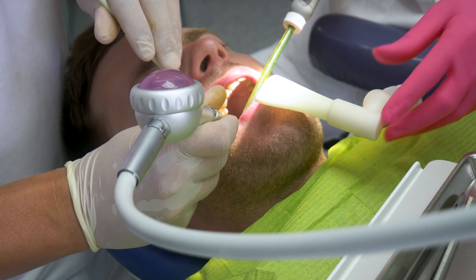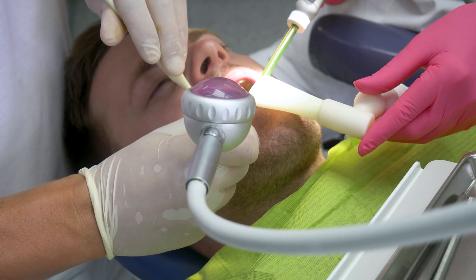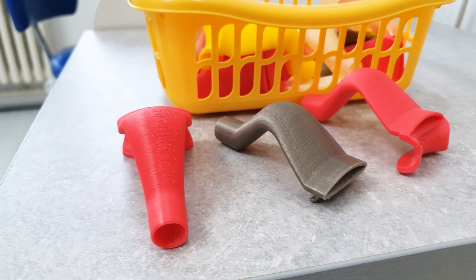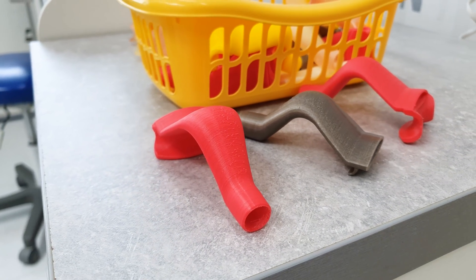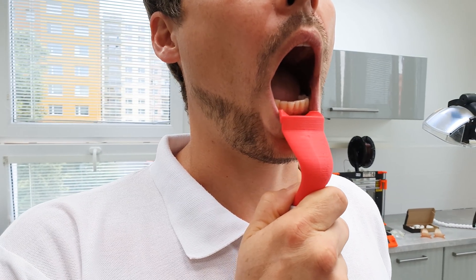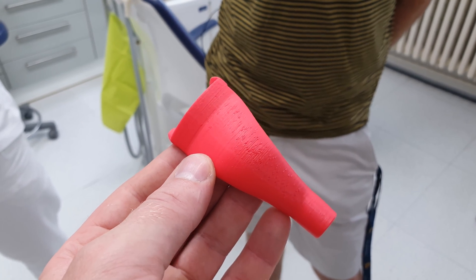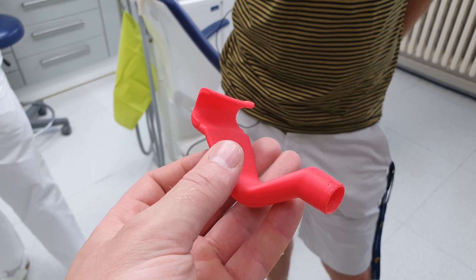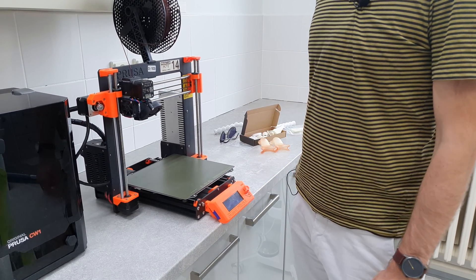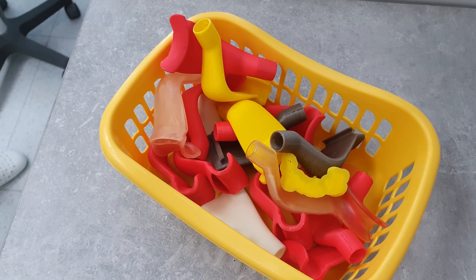Our goal was to find a solution that would allow us to catch this substance right at the source. So this is why we started to work on a custom-made suction system. We started with a simple suction head, which can be easily attached to the patient's lower lip, allowing the white inlet to capture aerosol particles. We made the first prototypes with an FDM 3D printer. I kept fine-tuning the design based on our testing and new ideas, then sent the model to Dr. Pima and he printed it in his office and we kept on testing.